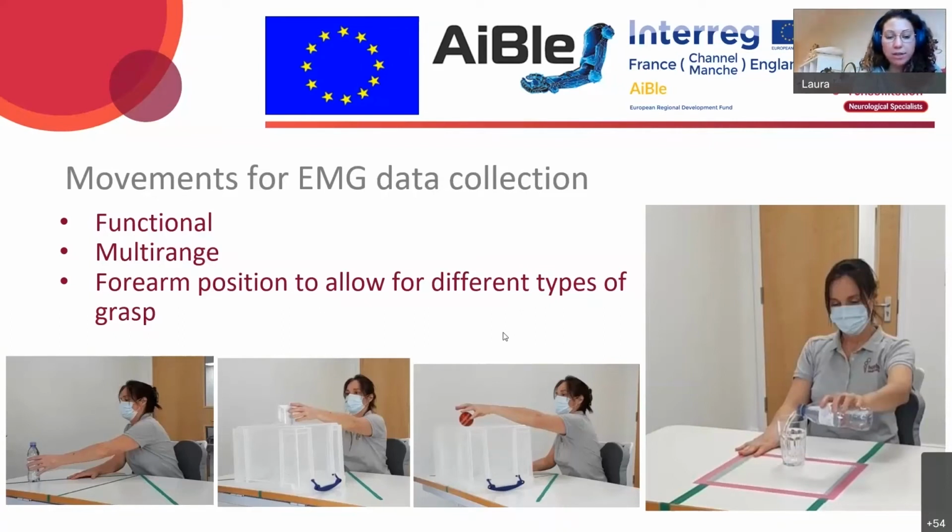Reaching up into a raised surface like a cupboard, pouring a glass of water, opening a jam jar, and cleaning or wiping a surface. All movements were completed across multiple and predetermined trajectories, and objects and reach points were systematically measured and positioned at the individual's mid-range to allow for more comfort and also reduce the amount of forward flexion in the torso.